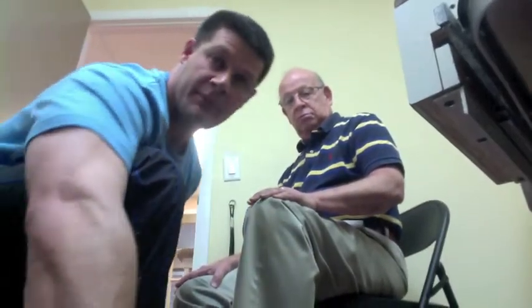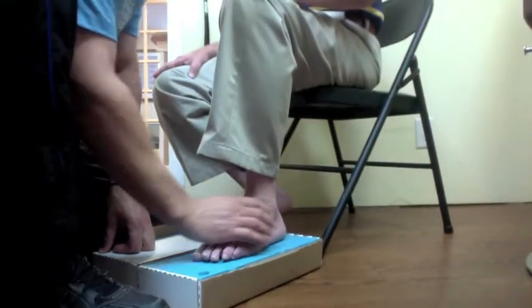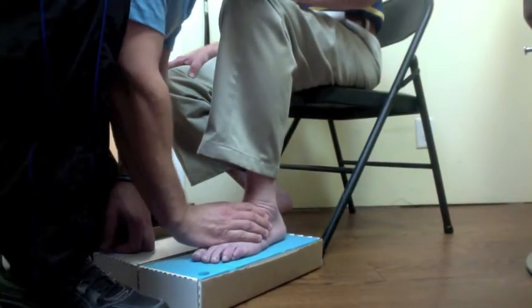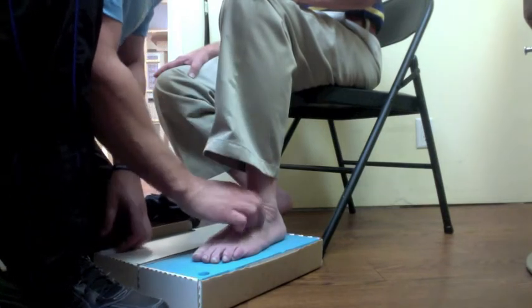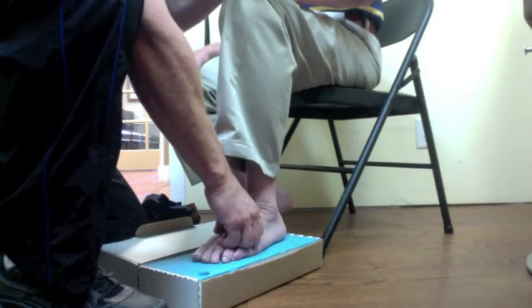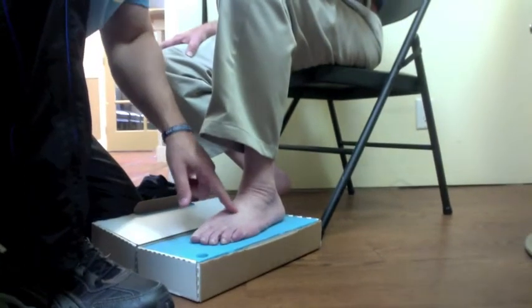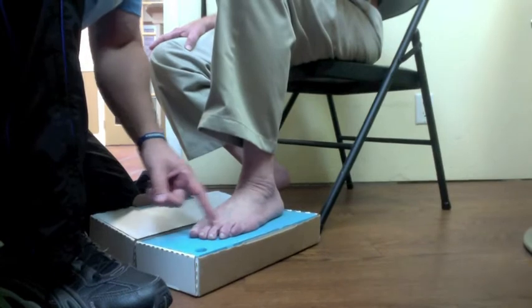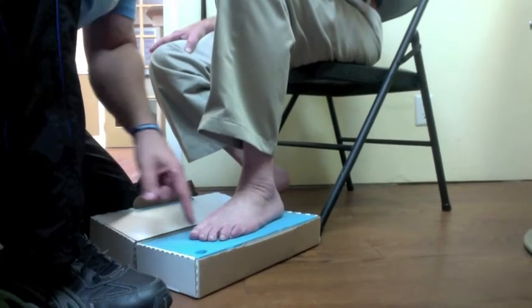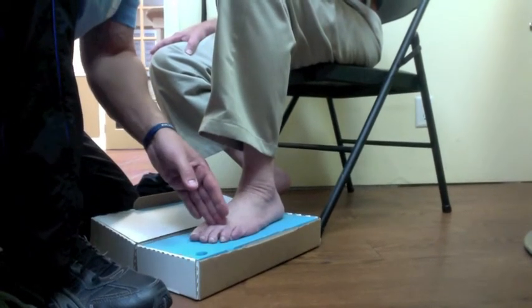What you're going to do here — let me slide this back as much as possible — is relax, with her hand on the knee. But before you do that, I want you to see what's on the bottom. You're going to take the foot and press it all in at one time. Usually you want to get the front of the foot — I usually do this and press it in at the same time I'm pressing here. This drives the heel in, and your hand drives the rest of the midfoot in. The toes don't matter; they're going to stay up a little bit, and it doesn't make any difference because the toes are very unimportant in the orthotic. The orthotic works from the back. So you want to press here and at the top.